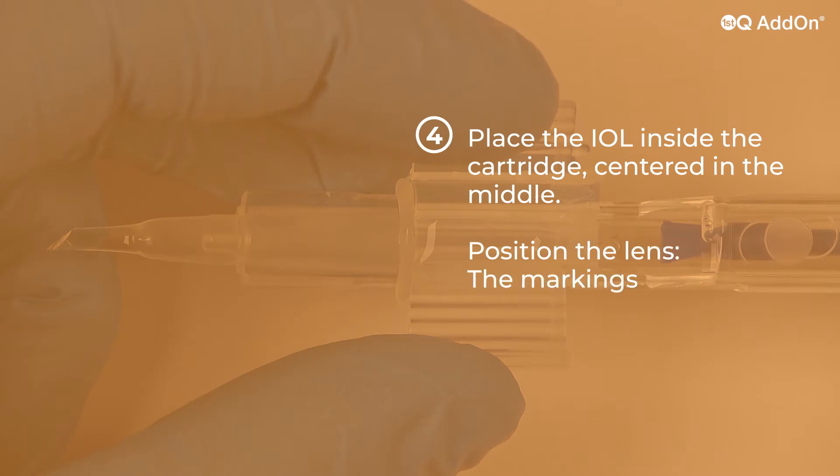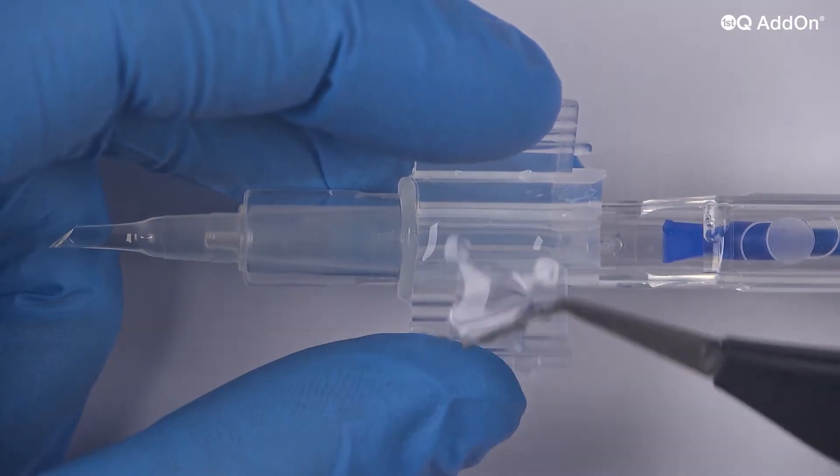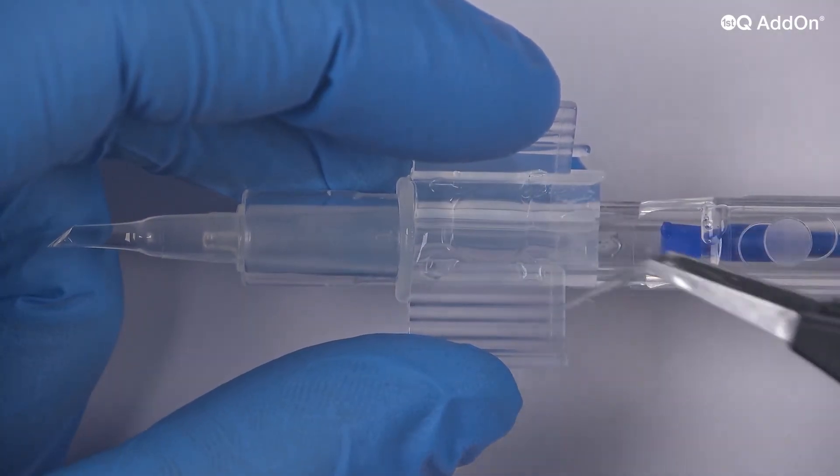Fully open the wings with your index finger and thumb, then place the IOL inside the cartridge centered in the middle. The markings should be at 4 o'clock to the right and 10 o'clock to the left.